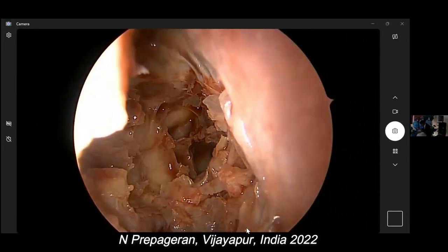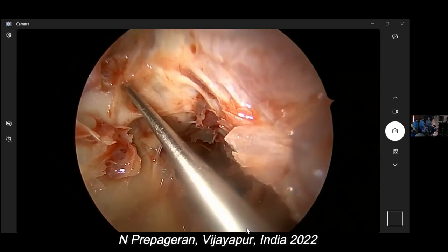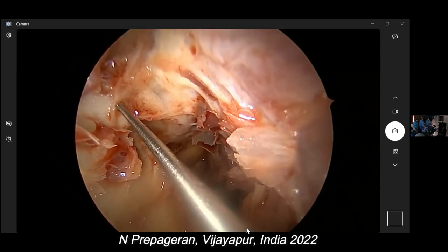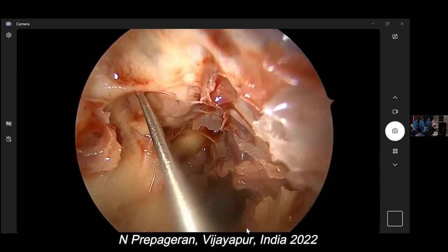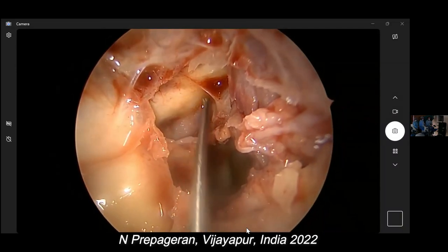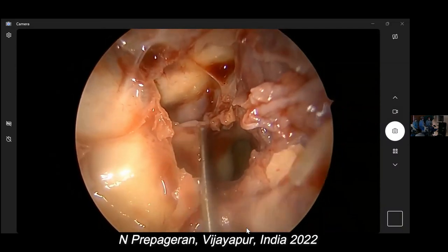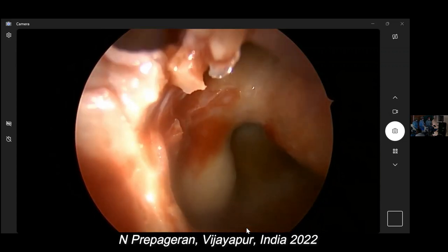Okay. So that's your anterior ethmoidal artery. Can you see? It always goes anteromedial. Okay? Right. Middle ethmoidal vessel. Posterior ethmoidal vessel. Optic nerve in an Onodi cell because there's a horizontal shelf. Sphenoid sinus.